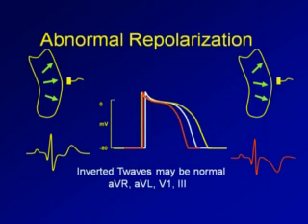And the subendocardium tends to be the first area to become ischemic. So what happens then is the region that's ischemic, the T-wave vector flips over. The short version of that is the T-wave runs away from trouble. So where you see evidence of T-wave inversion, that may reflect local ischemia. So when we're talking about coronary disease and myocardial ischemia, Q-wave's infarct, ST segment injury, which means you're probably going to spill enzyme, and T-wave is ischemia.